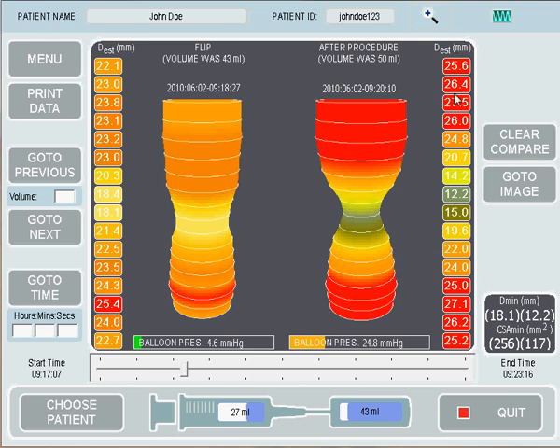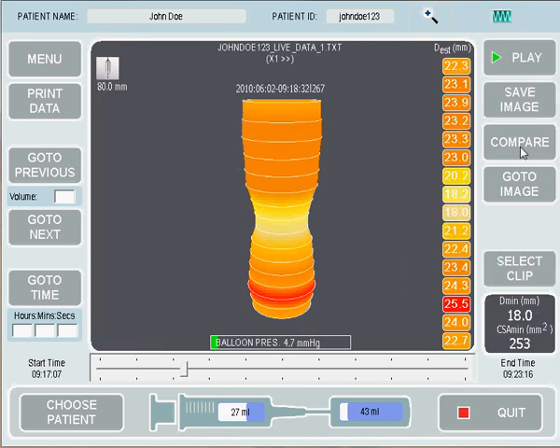The diameters for each snapshot are shown down each side, the pressure is shown below, and in the DMIN CSA section, the diameters on the left are for the left image and the readings on the right are for the right image. Clearing the compare then brings us back to our image.